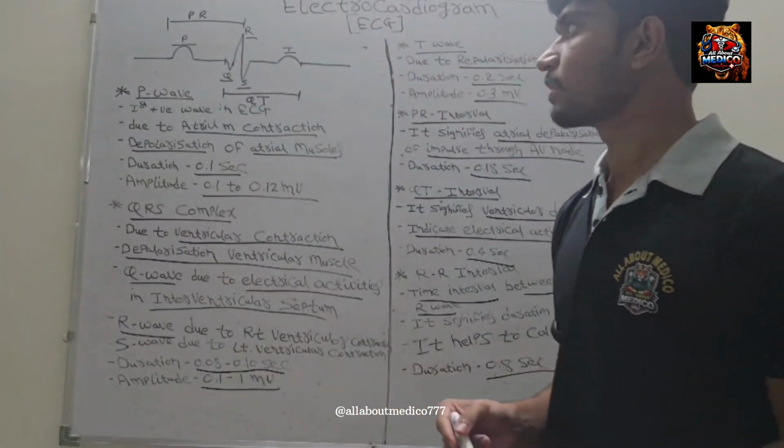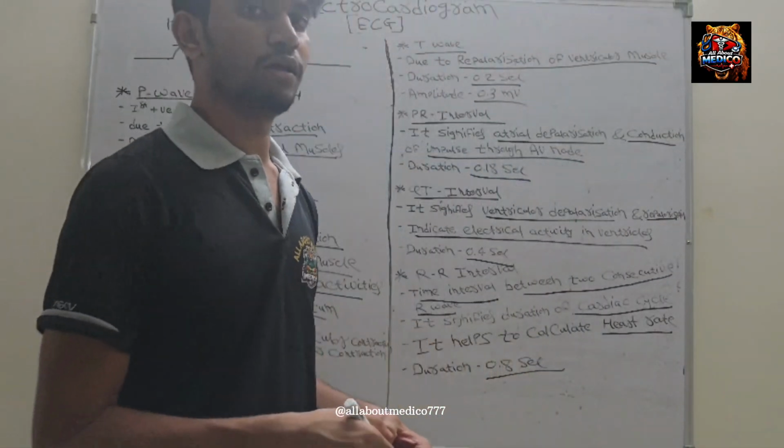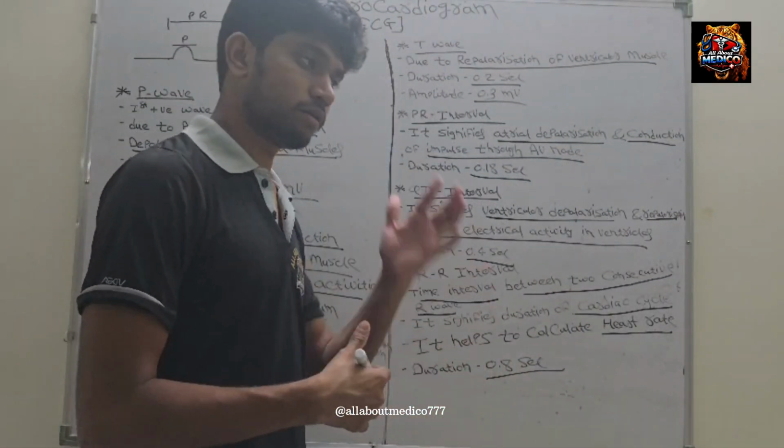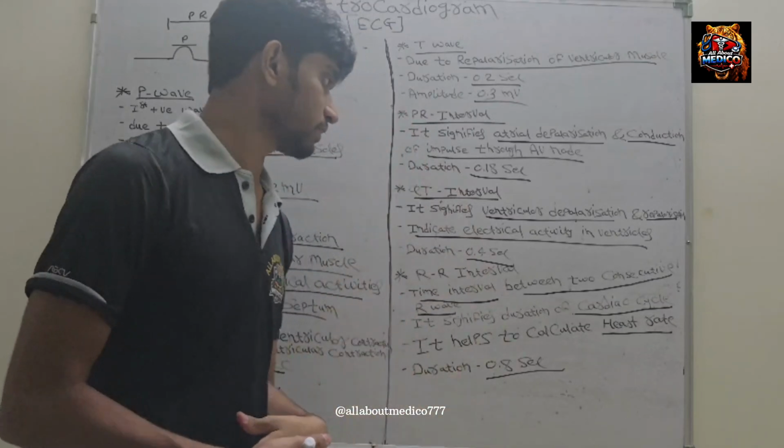Here we discussed ECG, the electrocardiogram, a graphical record of electrical activities of cardiac muscle.